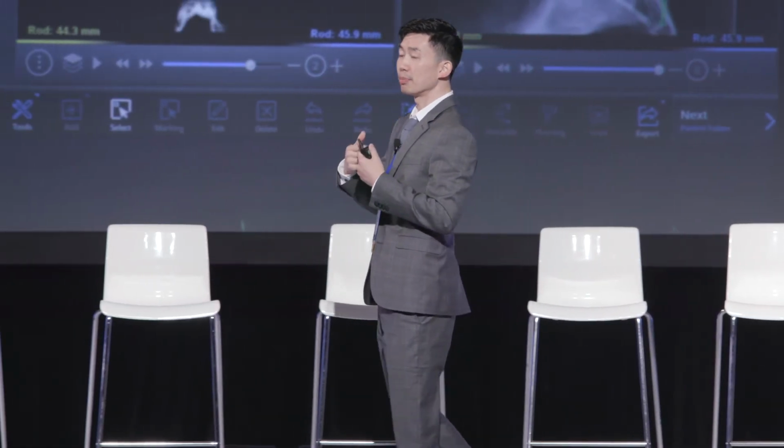I can zoom in, make sure that it looks appropriate, but since this is a minimally invasive application, I can also add towers. So now I can make sure that my incision planning at the skin makes sense. I can scroll through that and make sure that they're appropriate and intuitive for what I want to do with my patient. And in scrolling through, I can also, again, have that last check as if it's a post-op CT scan, that my screws would be all in bone on all of those screens. And so again, this is what would be the final construct. 2-minute video in real time, less than 5 minutes.